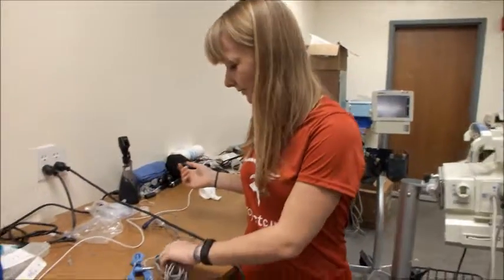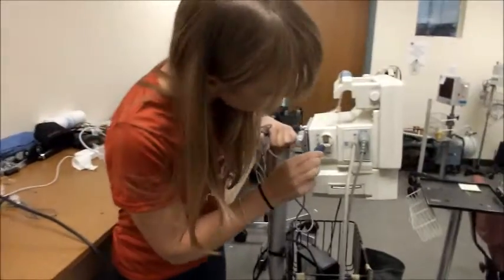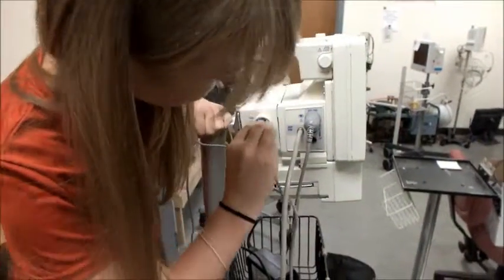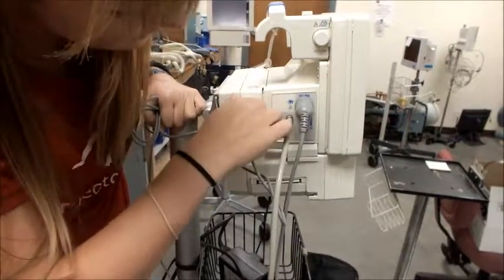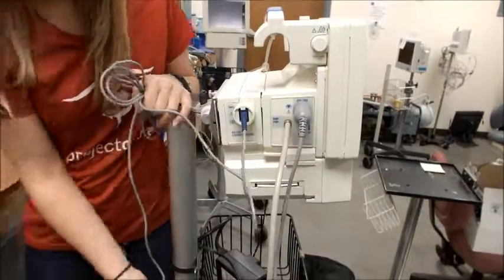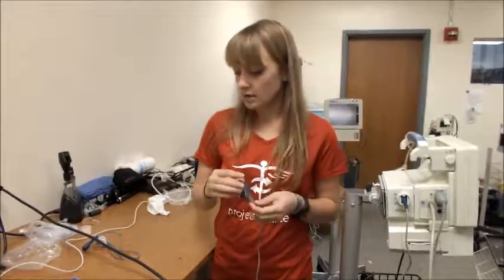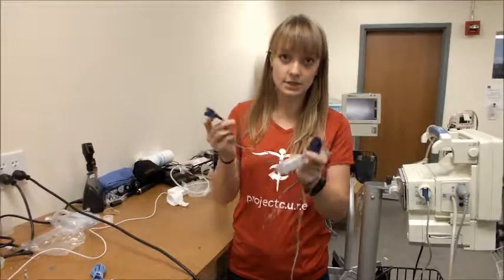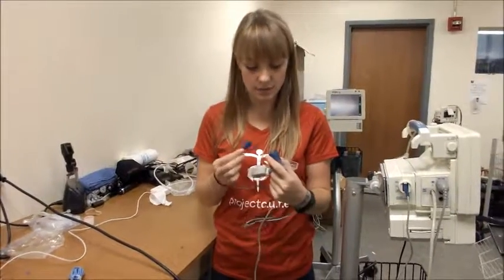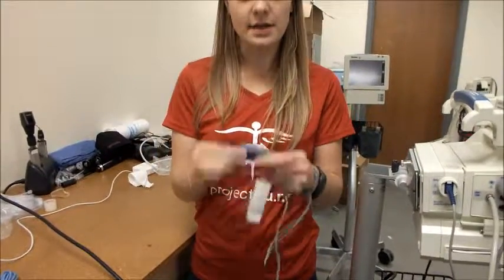Next we have the pulse oximeter. This is the correct connection for the pulse ox testing part. You want to make sure that you lock in the pulse ox cord so that you don't get an error in your reading. On the other end of the pulse ox cord is a connection where you'll need to find a finger probe that can clip into the connection. The connection should click in completely so that you can reattach the lid to the pulse ox cord.